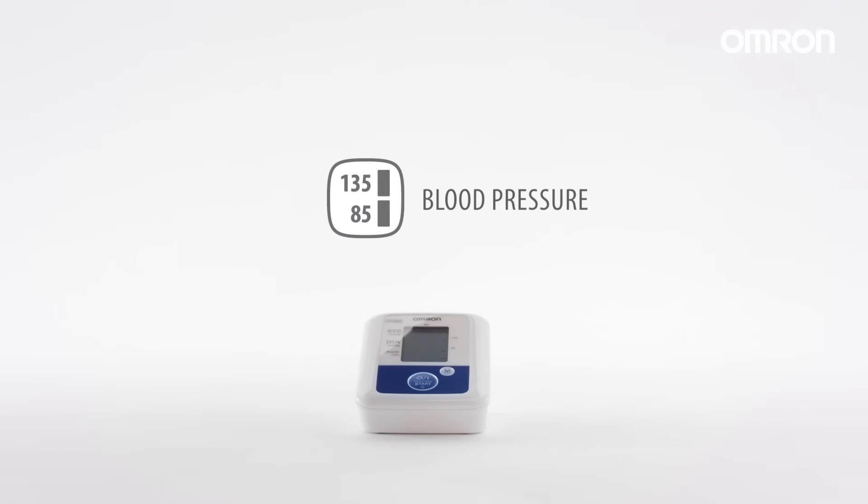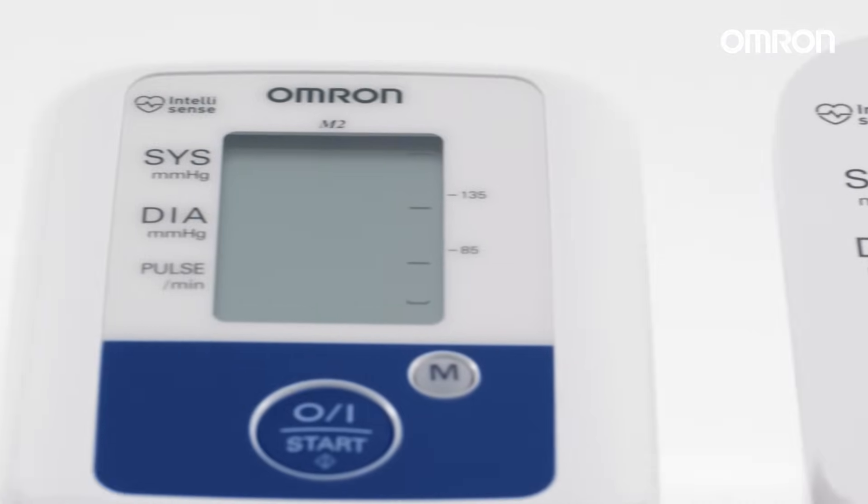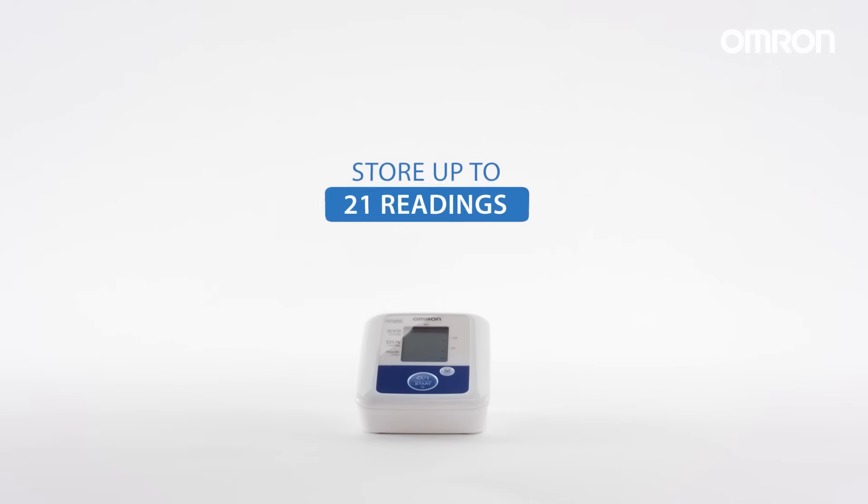The blood pressure level indicator provides an indication of where your results fit within the range for home blood pressure measurements. The M2 has a memory that will store up to 21 readings, allowing you to track your blood pressure over time.